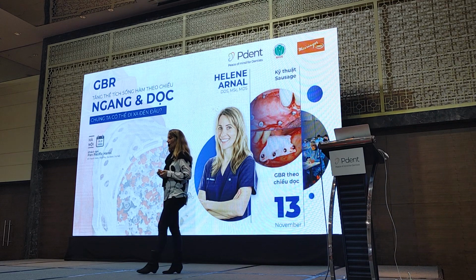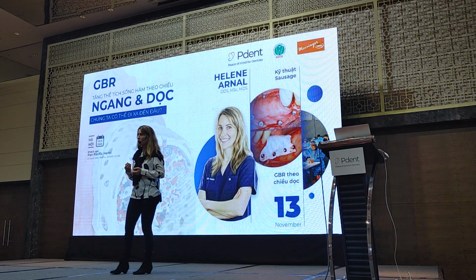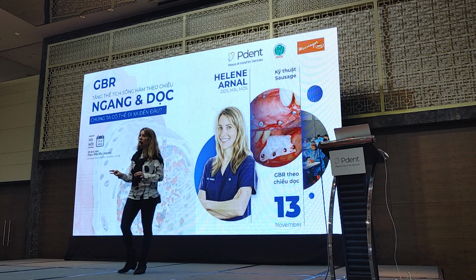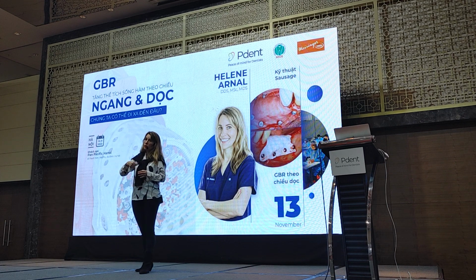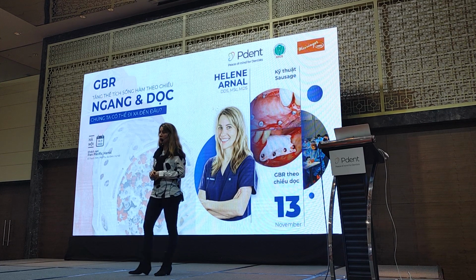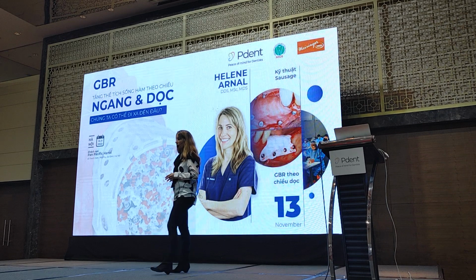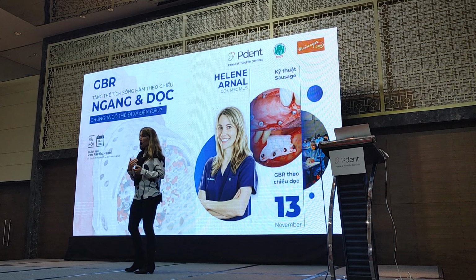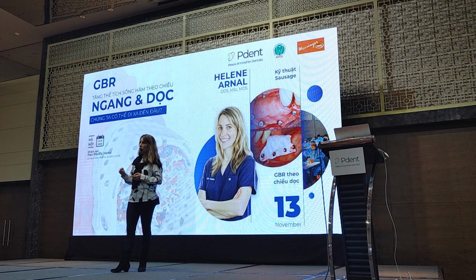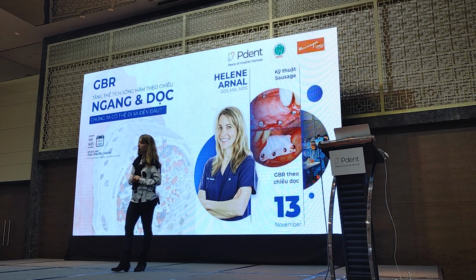But on the palate it can happen. So you can use a matrix to cover the hole, or you can do some suturing, because if it's deep, you can just suture it and it's okay. Or you can use a collagen pack if you want. But in my practice today, I am harvesting a thin strip, so I'm doing nothing.